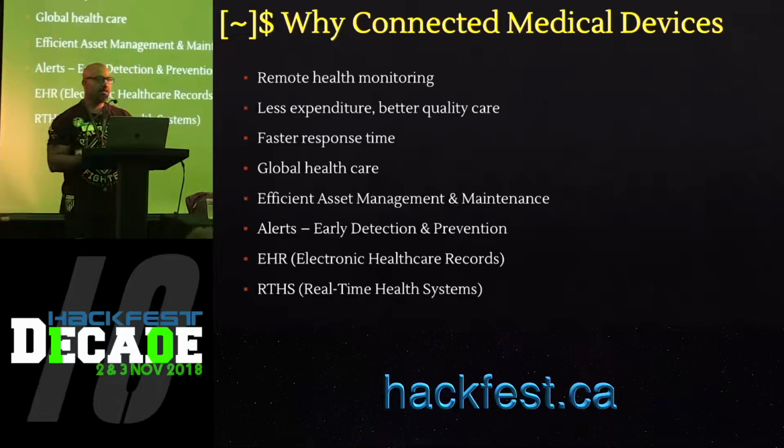So we spun up a virtual machine, gave it the same NetBIOS name as the infusion pump was looking for, and just brought it up in the network. As soon as that happened, the infusion pump started to send packets to the pump server. We studied the packets for a while, and it looked like it was loosely based on XML, and we were able to extract certain parameters.